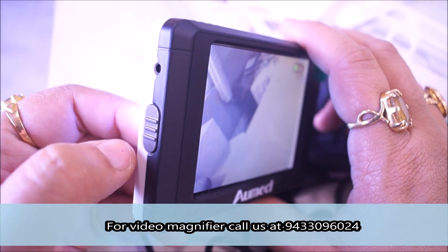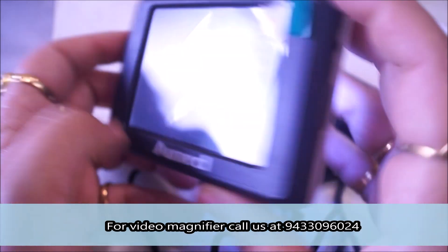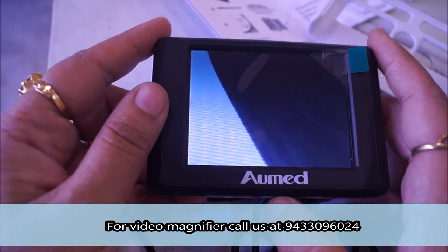You can see there are two switches — one is at the left end and one at the right end. The right end is for magnifying and the left end is for reducing the magnification. I will show you the demo.